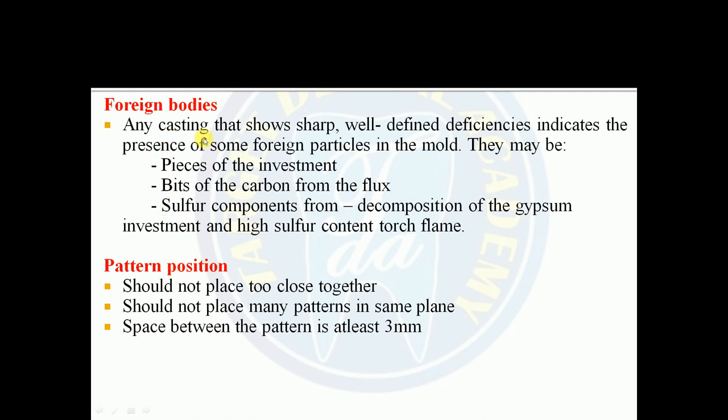Foreign bodies: any casting that shows sharp, well-defined deficiency indicates the presence of some foreign particles in the mold. They may be pieces of investment, bits of carbon from the flux, or the sulfur component which forms from the decomposition of gypsum investment, or maybe high sulfur from the torch flame. So patterns should not be placed too close together, and many patterns should not be placed in the same plane. Space between the patterns should be at least 3 millimeter.